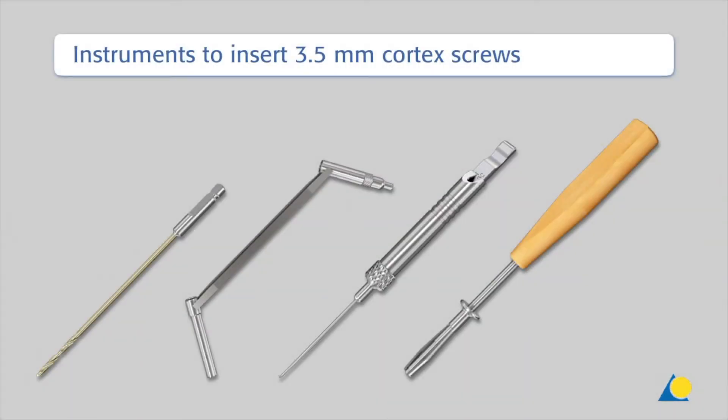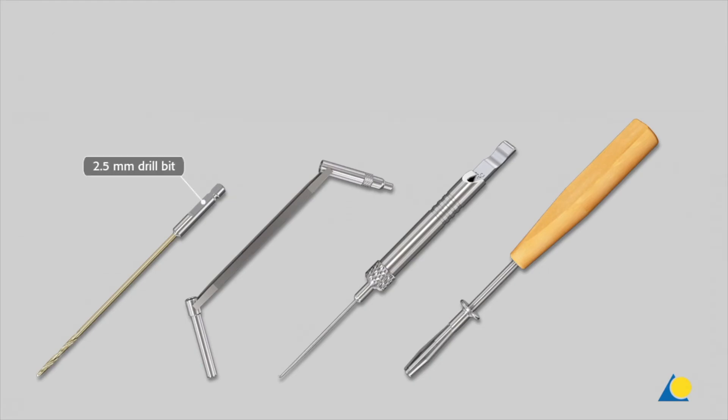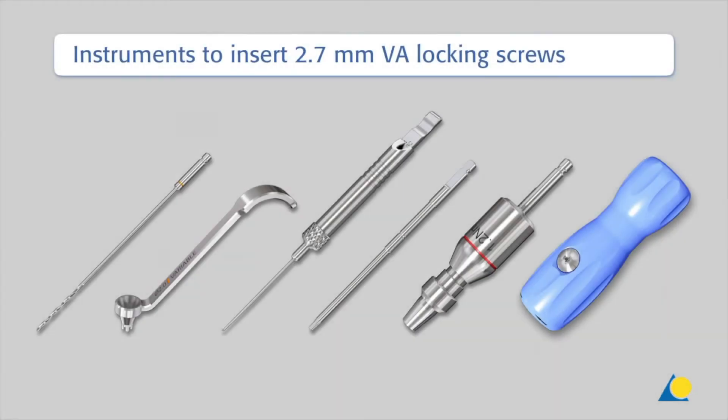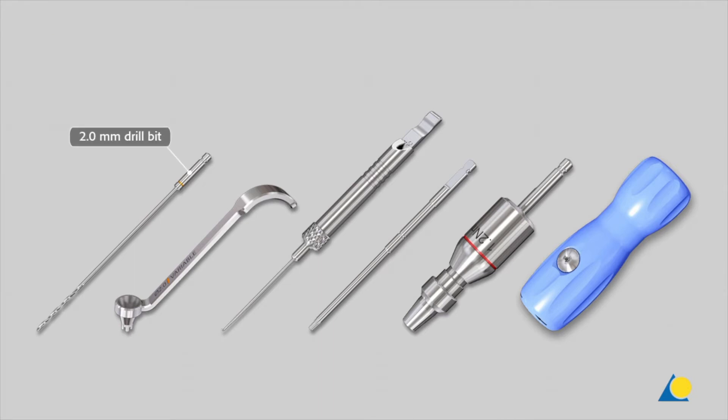Instruments to insert 3.5 mm cortex screws are: the 2.5 mm drill bit, the universal drill guide 3.5, the depth gauge for screws 2.7 to 4.0 mm, and the small hexagonal screwdriver with sleeve. Instruments to insert 2.7 mm variable angle locking screws are: the 2.0 mm drill bit, the VA-LCP drill sleeve 2.7, the depth gauge for screws 2.7 to 4.0 mm, the star drive screwdriver shaft SD8, the 1.2 Nm torque limiter, and the handle for torque limiters.